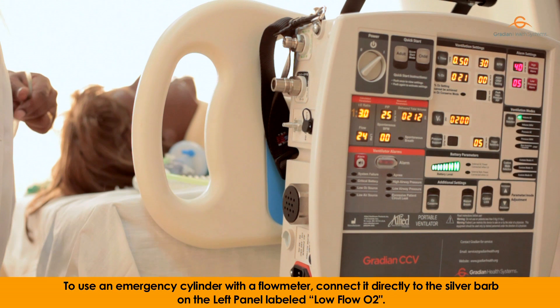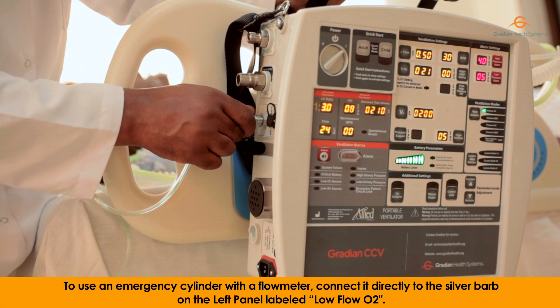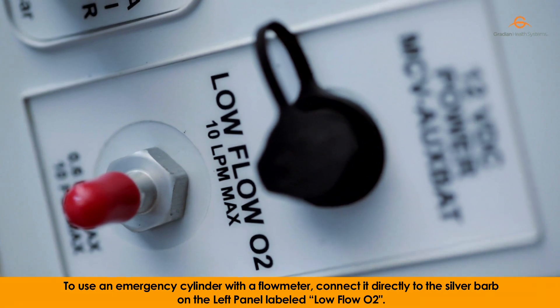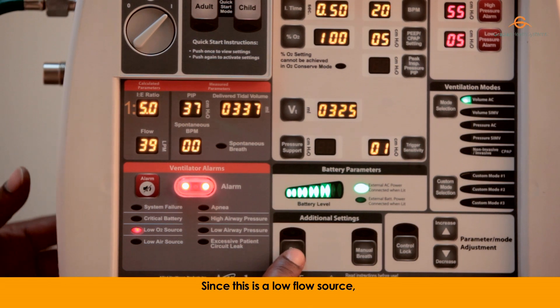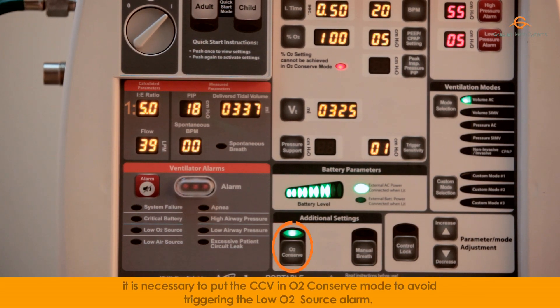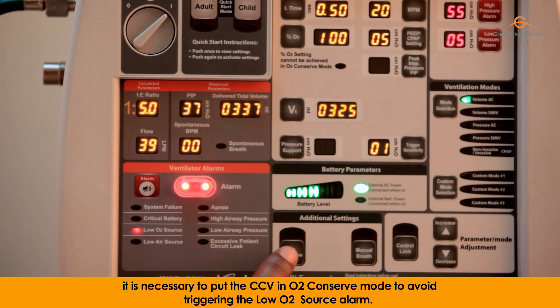To use an emergency cylinder with a flow meter, connect it directly to the silver barb on the left panel labeled low-flow O2. Since this is a low-flow source, it is necessary to put the CCV in O2 conserve mode to avoid triggering the low O2 source alarm.